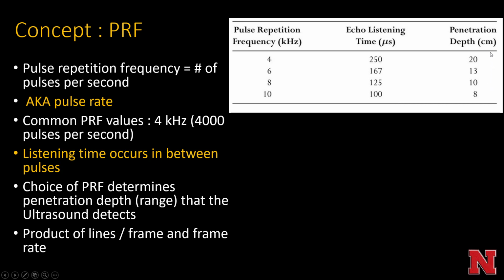And then your penetration depth is actually going down. So as your PRF goes up, your ability to penetrate into the body goes down.